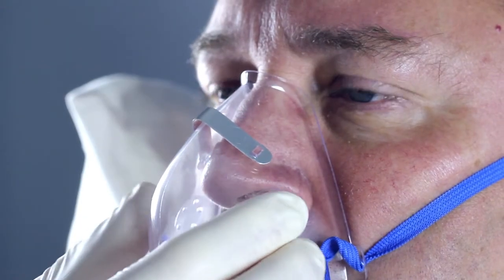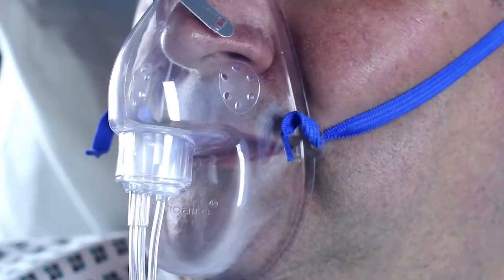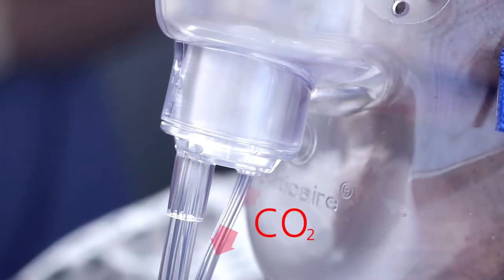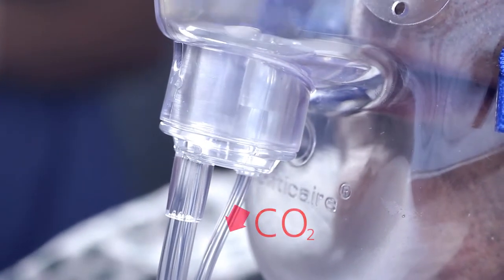The dual capnography mask delivers accuracy with every breath. The mask can be fitted comfortably over the ears and secured with the head strap. The soft, pliable mask molds easily to the patient's face, whilst the feather rim provides maximum comfort. The mask is made of soft transparent PVC to allow clear visual inspection.